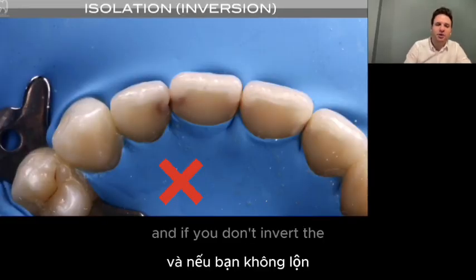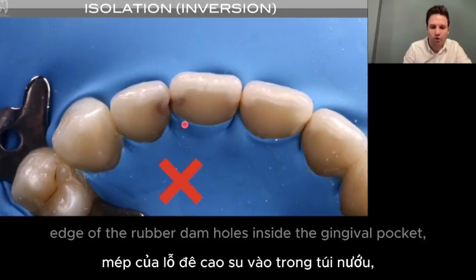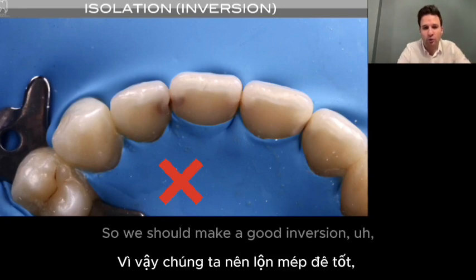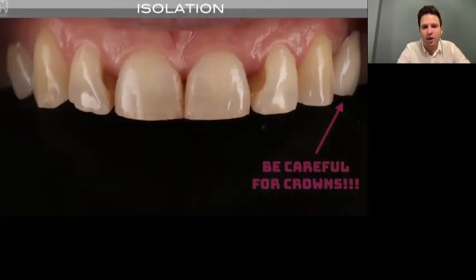And if you don't invert the edge of the rubber dam holes inside the gingival pocket, there will still be micro leakage from the gingiva to the tooth. So we should make a good inversion to create good isolation.